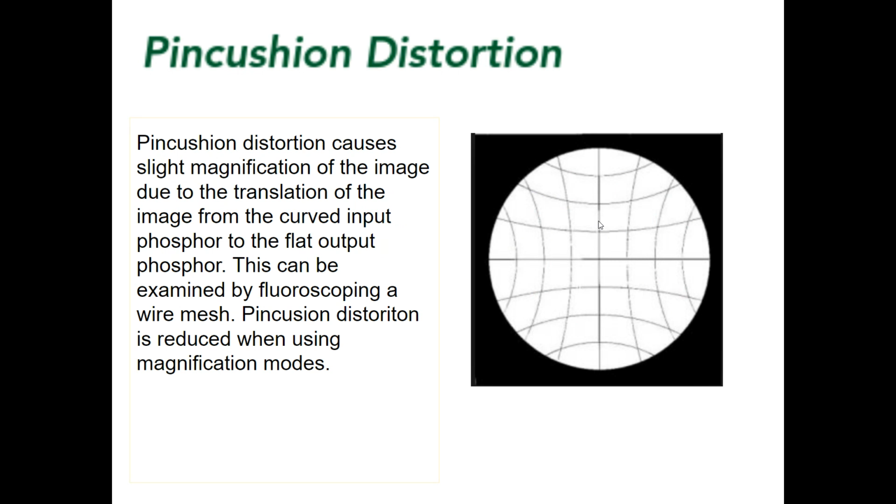So one type of artifact or reduction in contrast, I don't know if we would strictly call it an artifact, but something that will cause your contrast to be reduced, which is overall not a good thing, right? Is known as pincushion distortion.